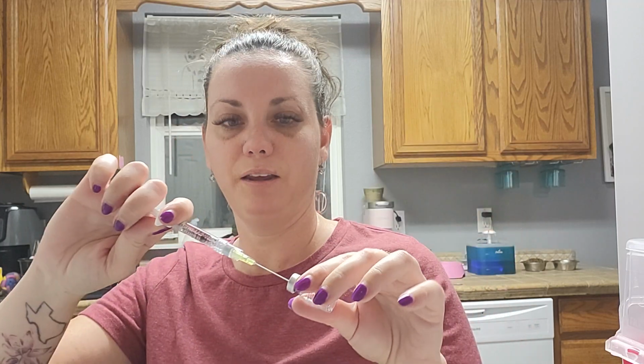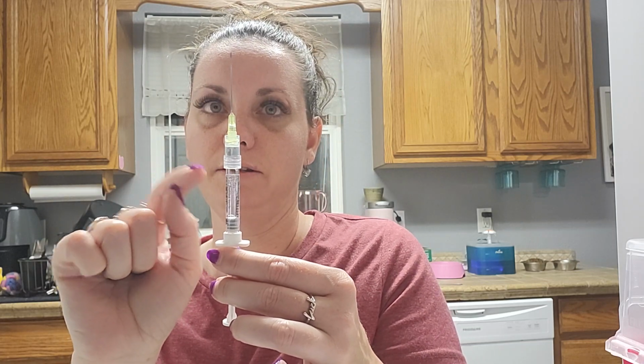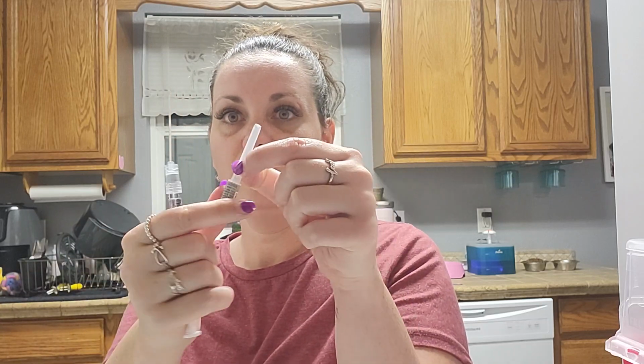All right, now that I've got everything back in my pre-filled syringe, I did leave a little space here, right? Because we're going to prime our injection needle. Put the cap back on your fill needle, which has the yellow, and take that off. And now we're going to want to do the same thing. Untwist the bottom of the gray needle.